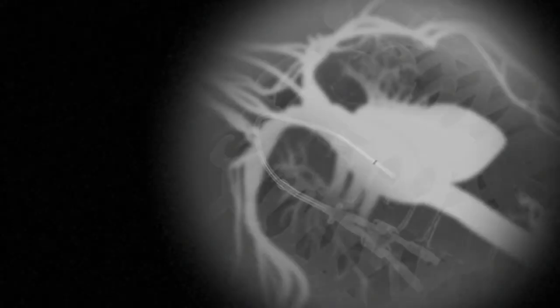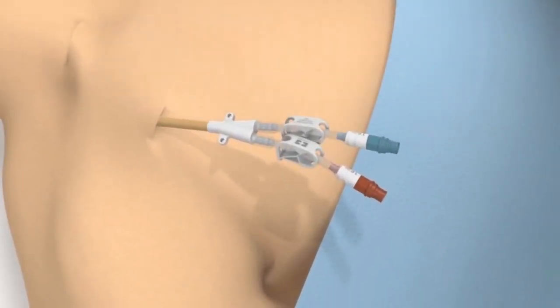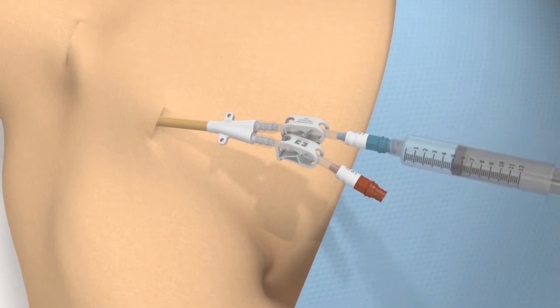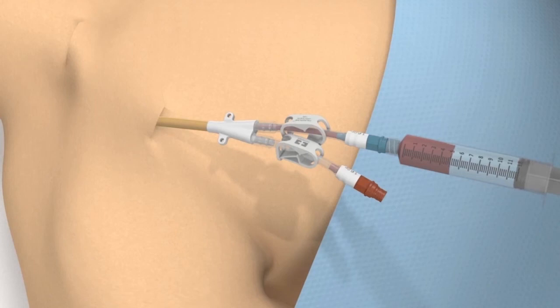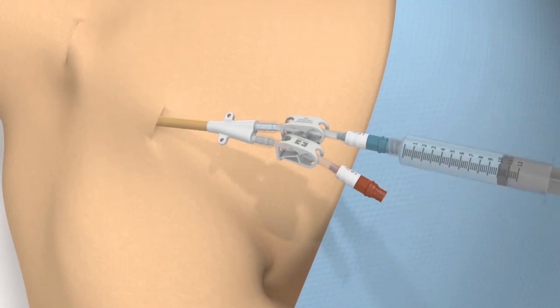Use fluoroscopy to view and confirm catheter placement, being sure to position the catheter correctly in the right atrium. Confirm catheter patency and function by aspirating venous blood from both the arterial and venous lumen. A rate of 5 cc per second or more represents good flow. Flush at least 5 cc of sterile normal saline into each lumen to clear the blood.